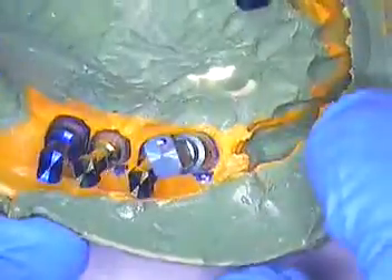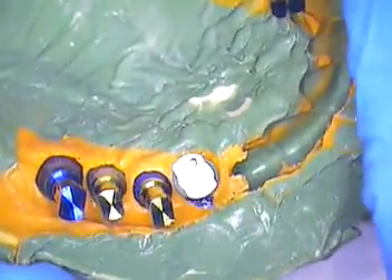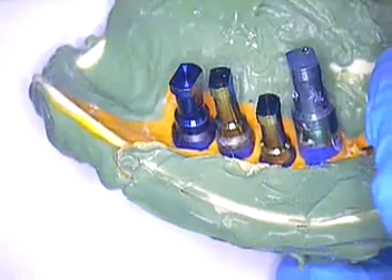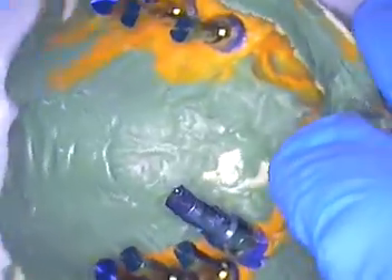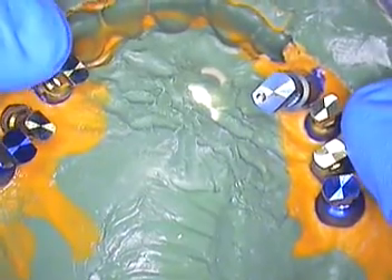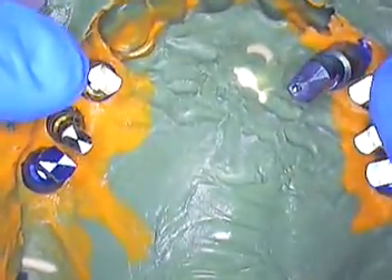I'll show you the position of that implant in the impression. You can see the color code is green for Nobel BioCare — one of the largest implants. It was placed on an angle that had to go more palatally because the buccal plate of bone was resorbed due to the fracture. The periodontist grafted that area and placed that implant first. Then the patient went back to have his sinus cleaned out, and subsequently a sinus lift and bone graft was placed, and then six more implants were placed in the maxillary posterior area.